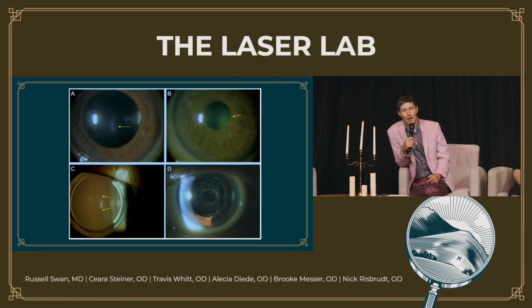I have seen this once. So is that just an inflammatory response there, or is it a scar? It's an energy response, and it will usually fade with time. I have seen it once before when someone else did it. It usually just fades with time, but it's quite alarming when it happens. When you're doing a YAG, you'll have focusing beams, and you would think it'd be really easy to make sure you're focused on the IOL and not the cornea, but there are enough case reports to say that it can sometimes be confusing. So again, just make sure you're focused on the right area.